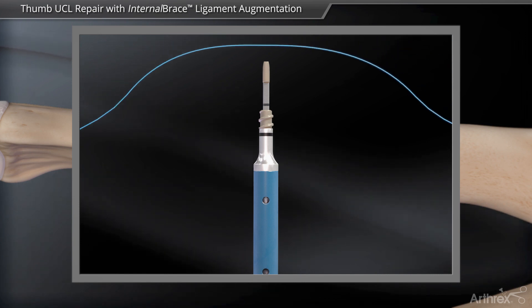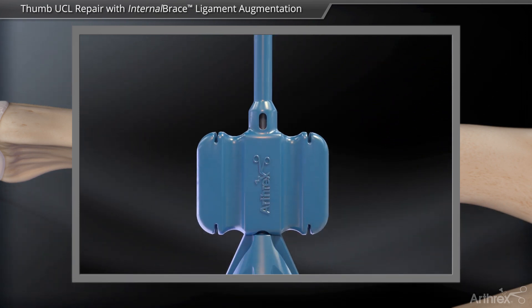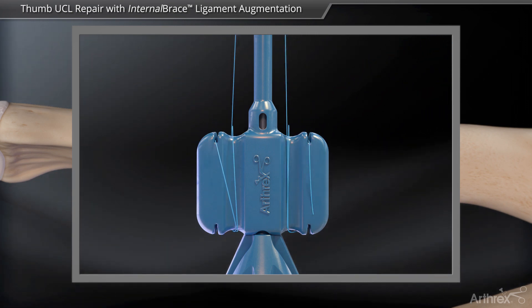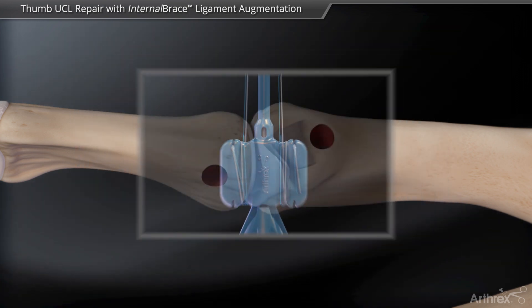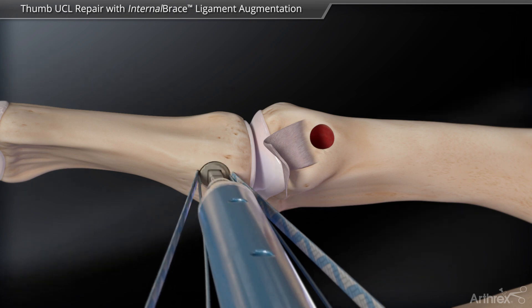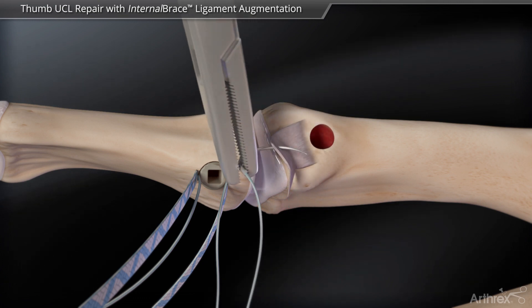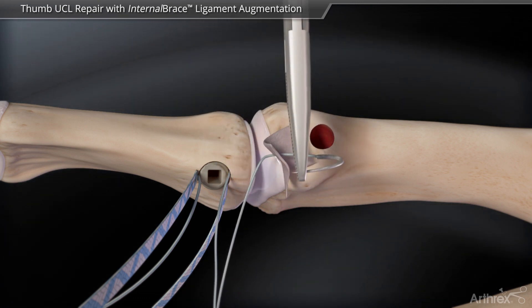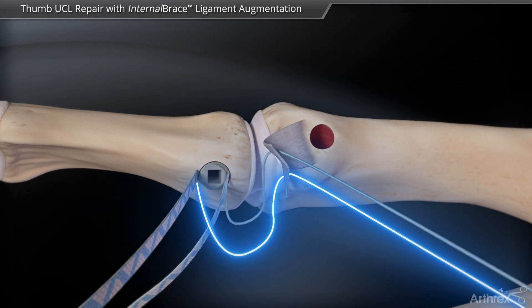Suture tape and 3.0 fiber wire suture are placed onto the forked eyelet of the swivel lock. Insert the swivel lock and sutures into the proximal phalanx. The 3.0 fiber wire is used to perform the primary repair of the ulnar collateral ligament down to bone.